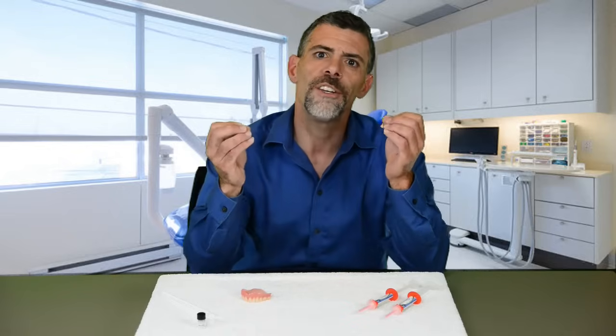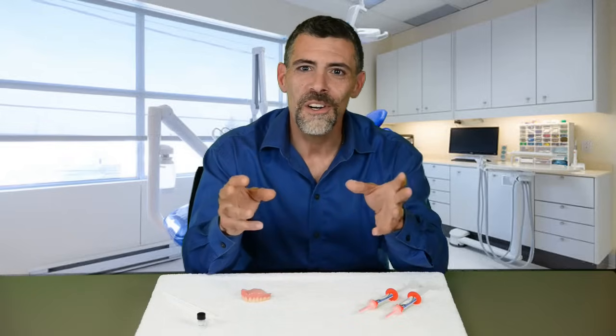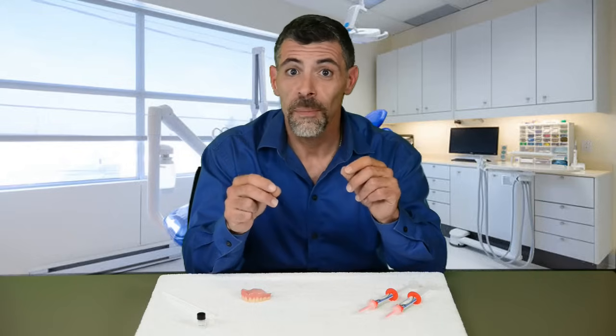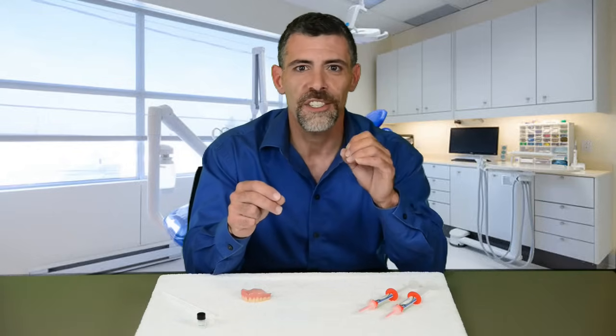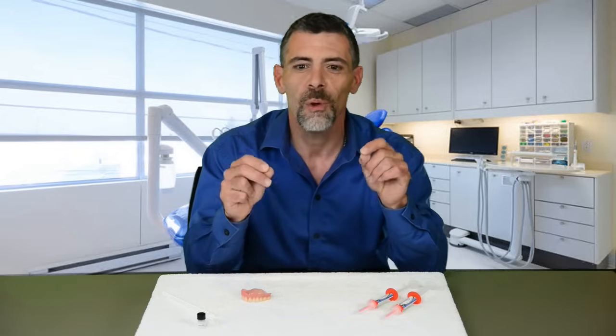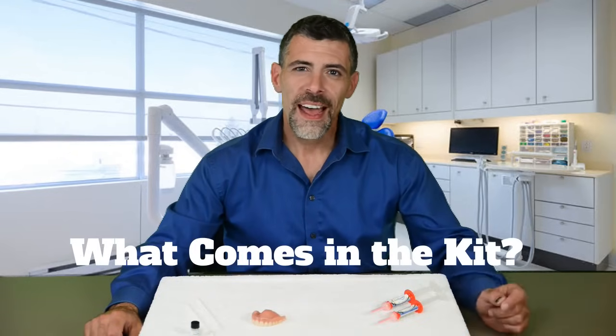Denture Fit requires accurate application — it requires learning and sometimes even trial and error. But don't worry, once you learn how to use it, you've got that learning for life. Plus, you have an excellent support team at Denture Fit who want you to get the best possible fit and will help you out.